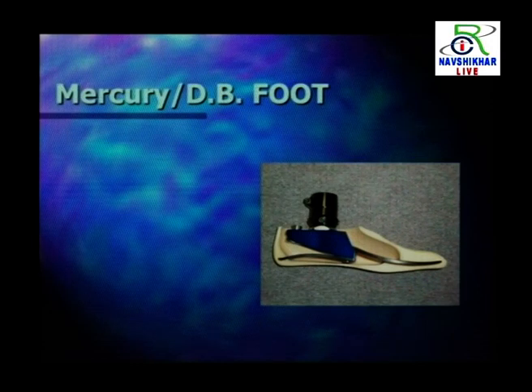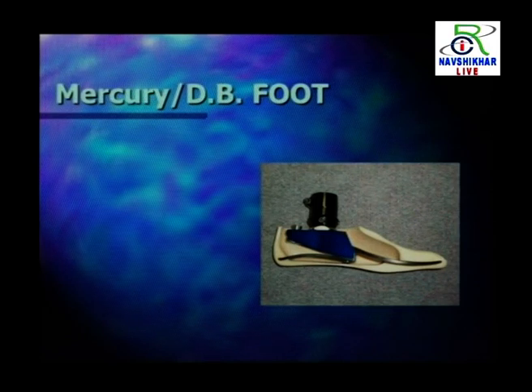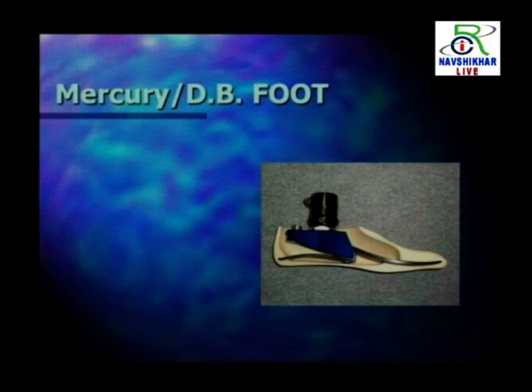This is the Mercury foot. In this type of foot, we can clearly show what the carbon fiber plate is, where the covering is, where the pyramid is, and where the ankle adapter is. There are a total of 4 modules. The first one is the endoskeleton. The carbon fiber foot plate can also be changed according to patient need. If the carbon fiber foot plate accidentally cracks or is damaged, only that foot plate can be changed, not the whole system. Then there is the main assembly, then the pyramid adapter, then the ankle adapter, and lastly the foot cover.